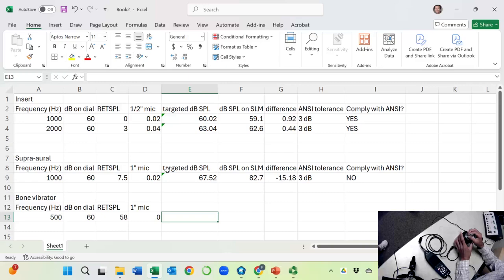Yeah, the artificial mastoid, right? So that artificial mastoid, this piece, I need to consider its frequency response. Same idea as I consider the frequency response of the microphone, because it's an important component of the setup. So I need to look up the frequency response of this artificial mastoid.